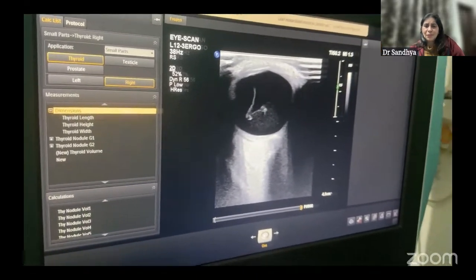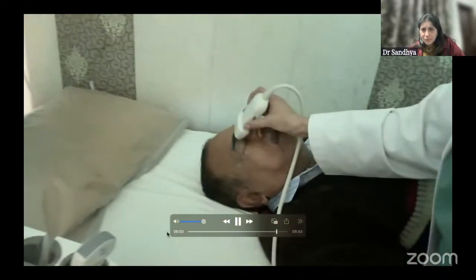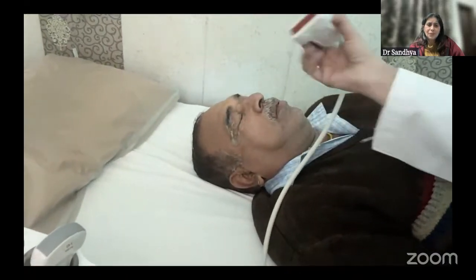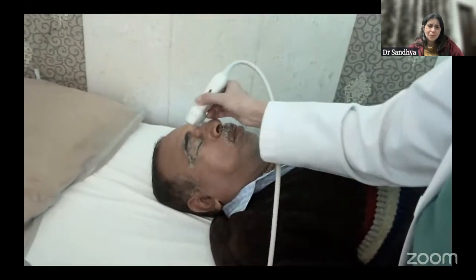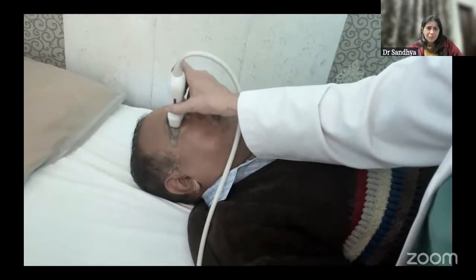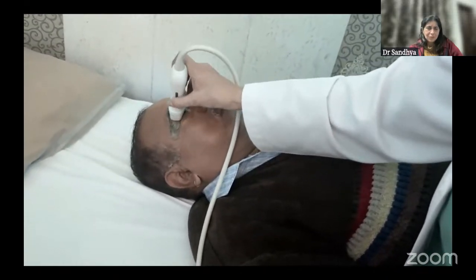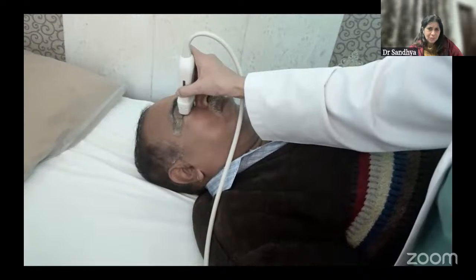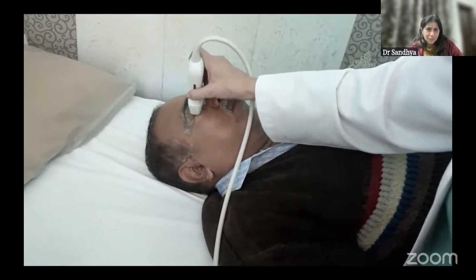If we come back to the patient side, now we focus here. Gently put the probe. I think you just need to refresh the fluid, a little bit of coupling fluid. Gently put it on the globe to get the orientation and just move it up and down to get the whole horizontal sections, and then right and left to get transverse sections of the whole eyeball. And wherever we see the pathology, we can fine tune and narrow down and then look for that detailing.